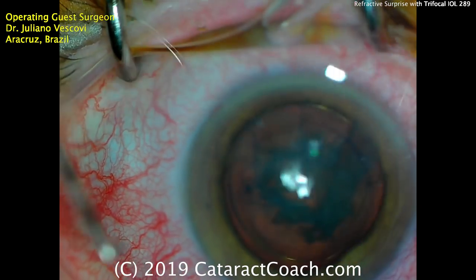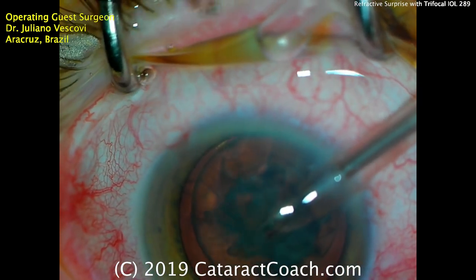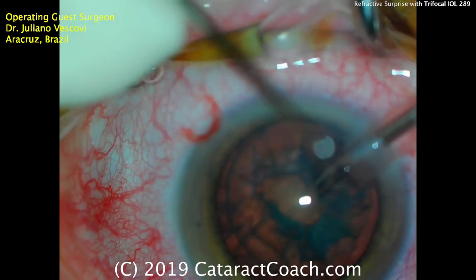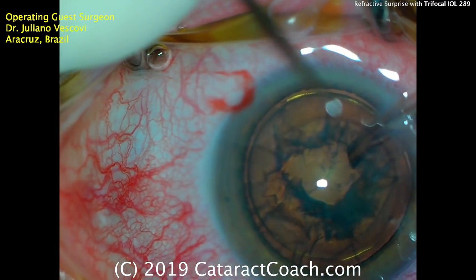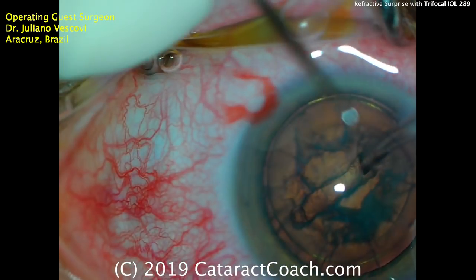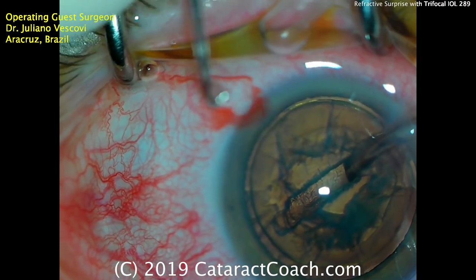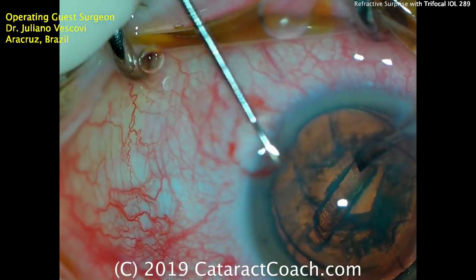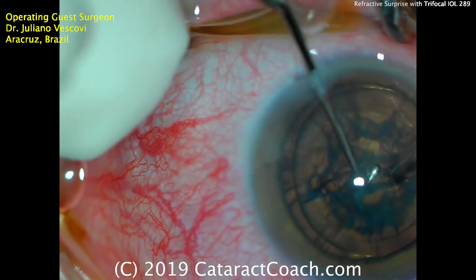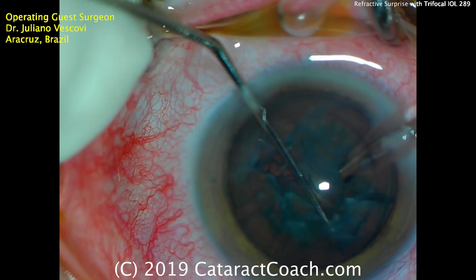Let's see what technique we're using here — a chopper going in one hand and the phaco probe in the other. It looks like a smaller 2.2 to 2.4 millimeter phaco tip and sleeve, so maybe a smaller incision. A groove down the middle — there's a nice trench being made — and that looks like pretty reasonable depth. Here comes the chopper, a standard style with a little ball tip on the end, and we're seeing if we can split the nucleus into two halves. That looks pretty good — making sure the crack is propagated fully.